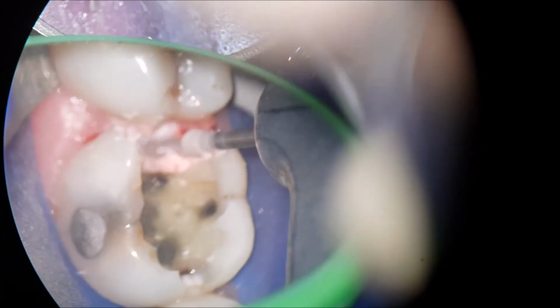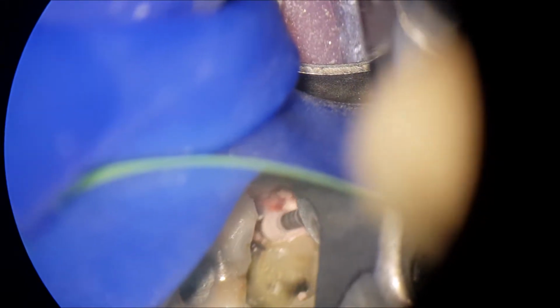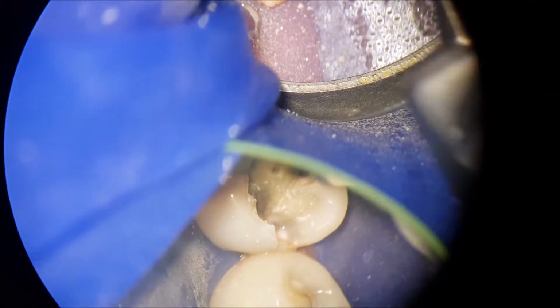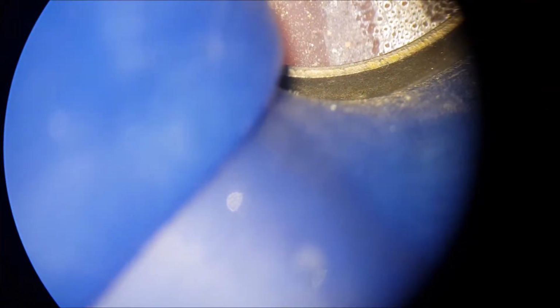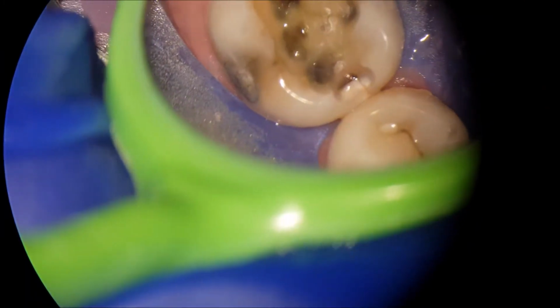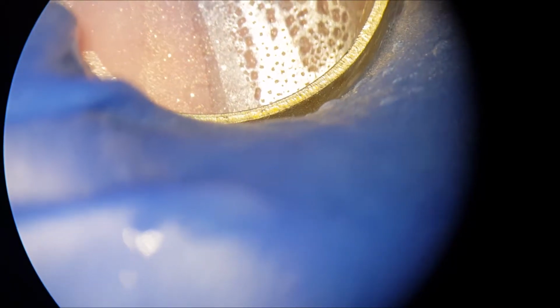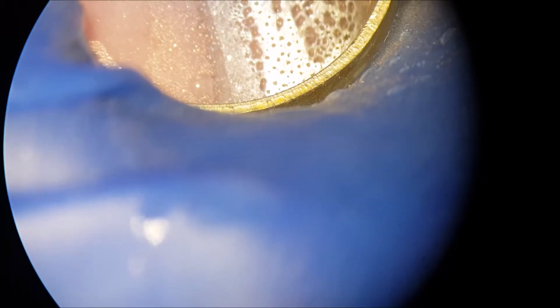Even though the stress fractures appear to be superficial at first, the caries, especially on the distal, was quite extensive. And you can imagine that the opening in the crack is probably like a highway for the bacteria to get in. It destroyed a fair bit of the distal wall, so a preoperative composite buildup was indicated. Also worth mentioning, there was no signs and symptoms of pulpitis at all.